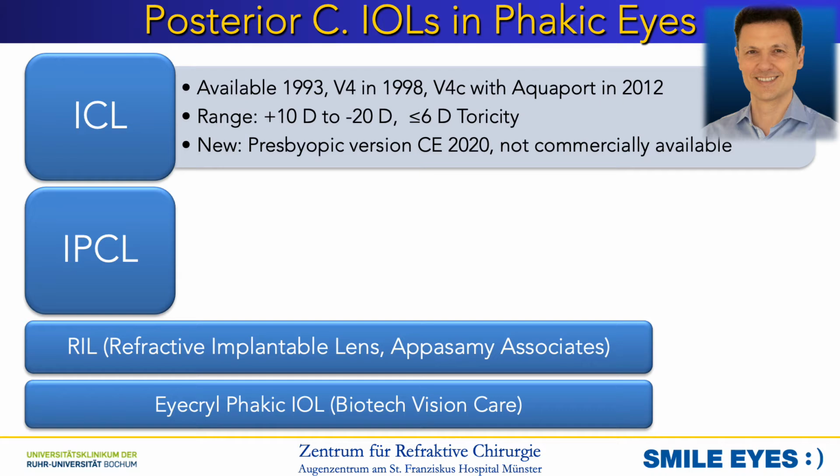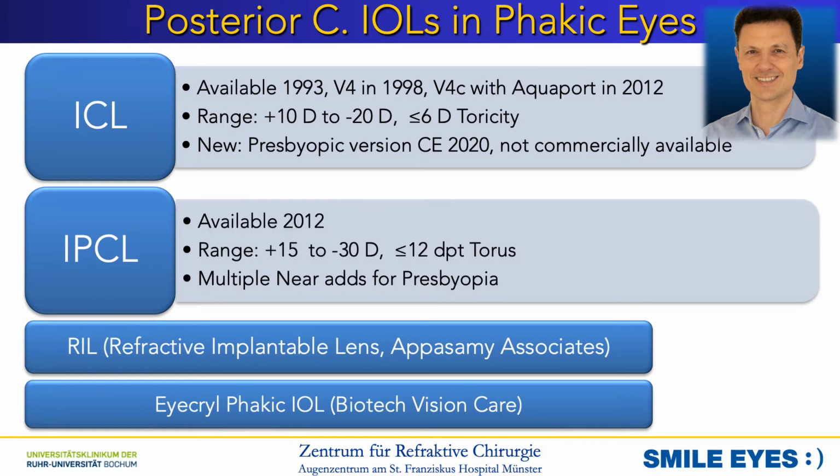Of note, the ICL is not commercially available in a presbyopic version right now, although the presbyopic version has gained a CE approval in 2020.